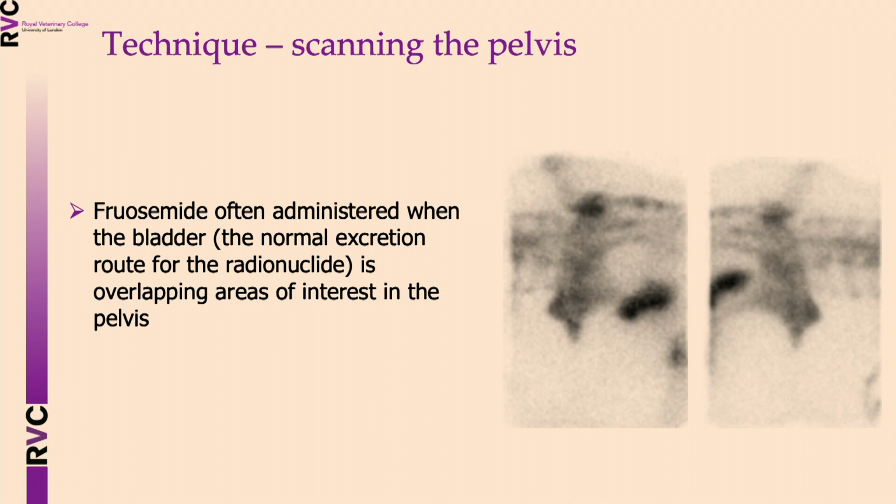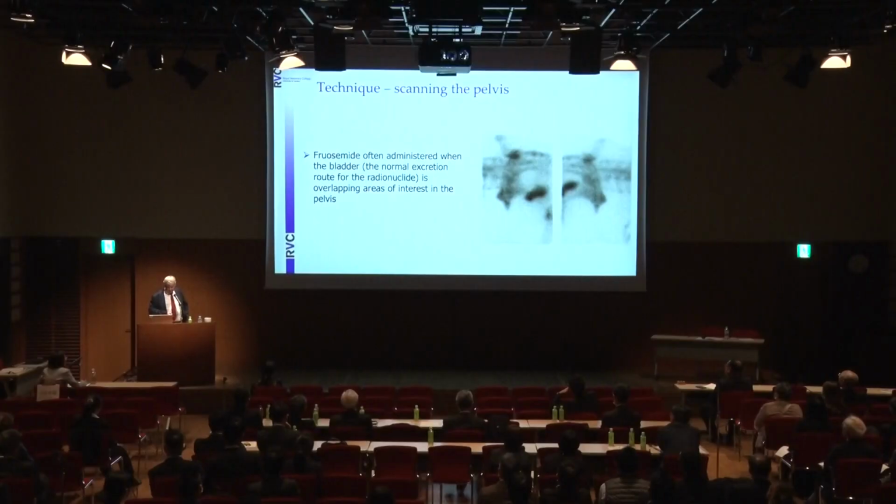Because this is the normal excretion route for the radionuclide, and it unfortunately obscures areas of the pelvis that we are interested in for pathology.